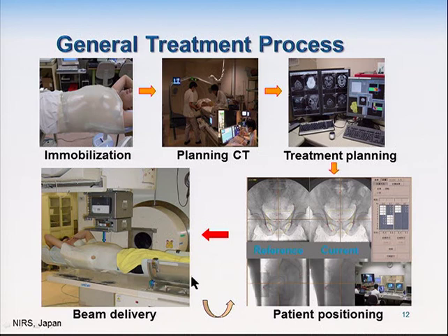But sometimes for peripheral type lung cancer, we do only 1-day treatment. So this can be shortened to only 1 day. For liver cancer, we do two treatments. This is very simple. But usually, the technique requires 2 or 3 weeks of consecutive treatment, a series of treatments like other conventional radiotherapy.